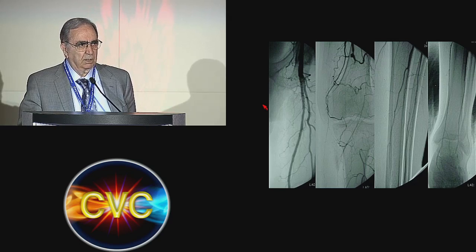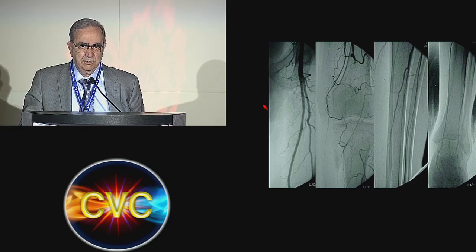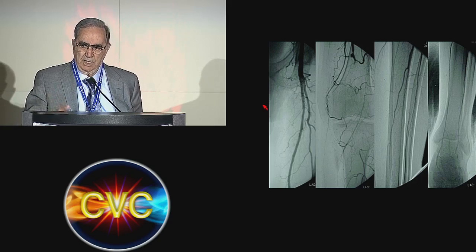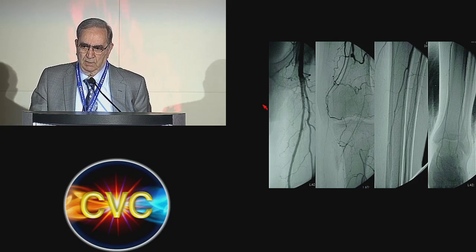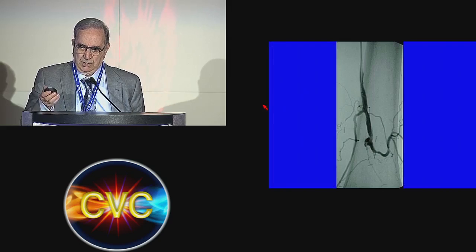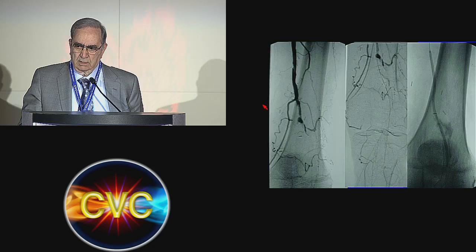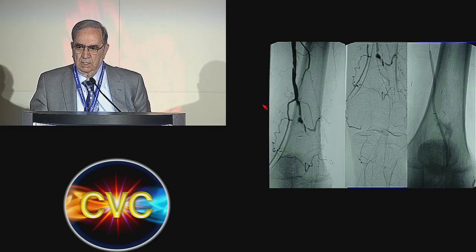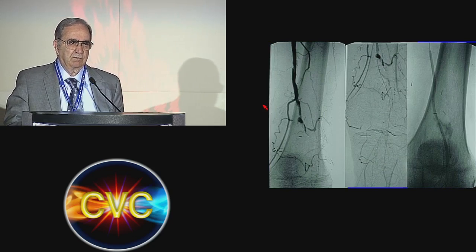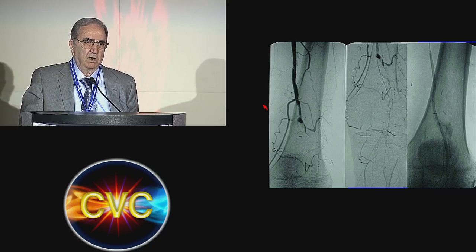When surgeons do this bypass surgery, most of them tie off the artery above the aneurysm. So I did lytic therapy, putting a catheter right into the graft, but he didn't respond. Most vein grafts don't, because they don't occlude because of thrombosis but because of very bad venous disease.